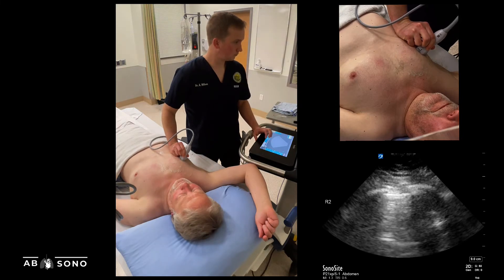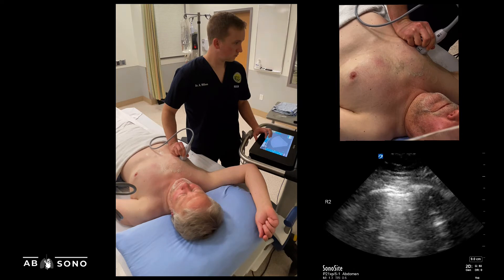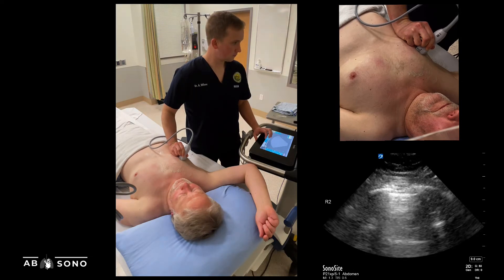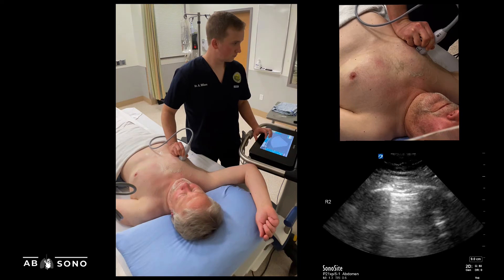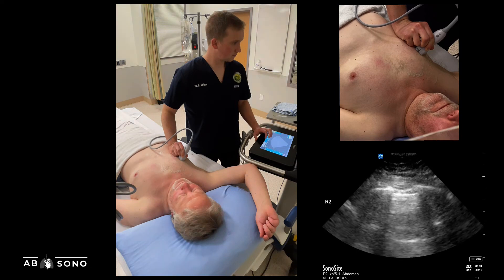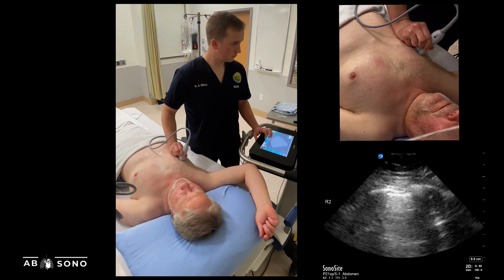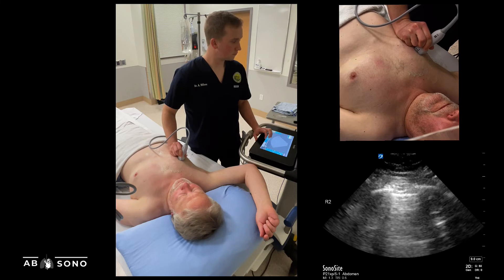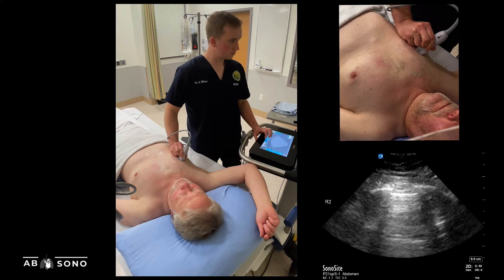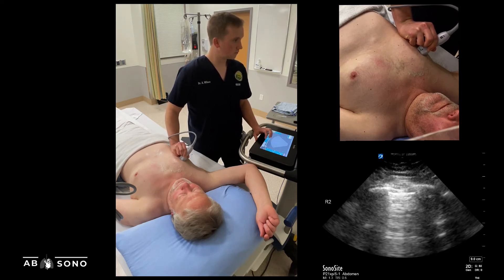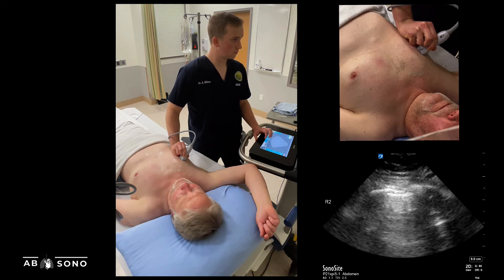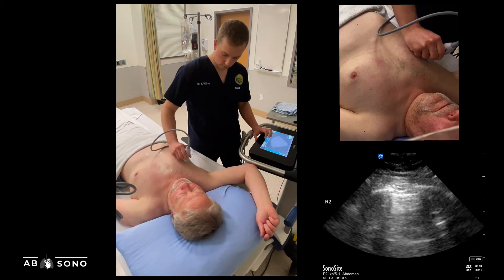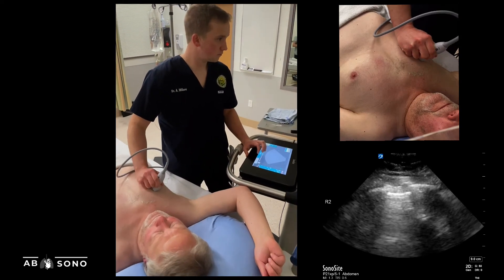A few optimization points when imaging zones 1 and 2. Ensure your probe is static with respect to the chest wall, as movement of the probe may confound assessment of lung sliding. To enhance the appearance of A and B lines, the probe should be held perpendicular to the pleural line. If image quality is low, slowly fan the probe towards or away from midline until the pleural line and A or B lines are clearly seen. When sliding laterally on the chest wall, the probe will need to be fanned towards the midline to maintain this perpendicular angle of beam incidence. If image quality remains poor, it can be helpful to obtain images from an interspace above or below, or slide the probe slightly medially or laterally.